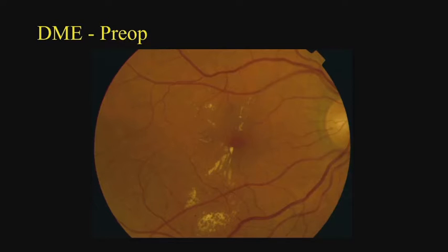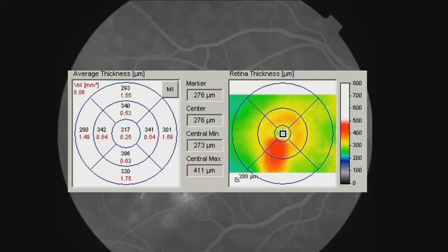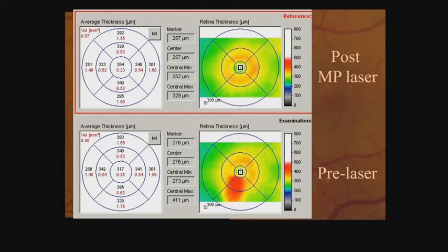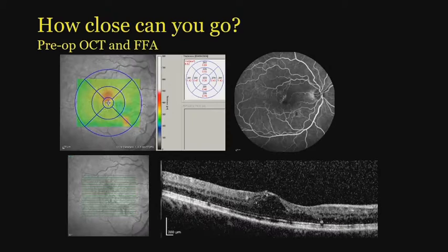So in DME, you can see here, edema there, and on the OCT, after one laser treatment only, the edema goes away with no visible scarring, as you can see there.